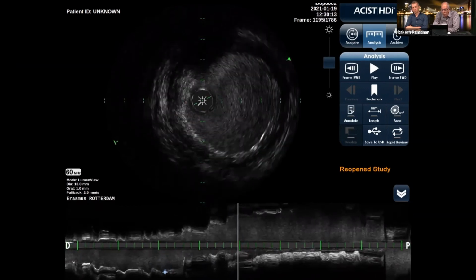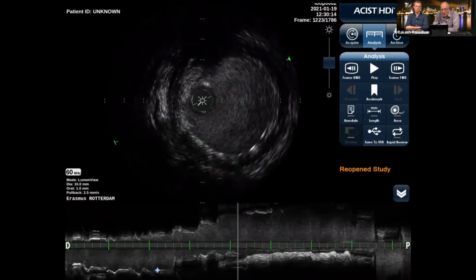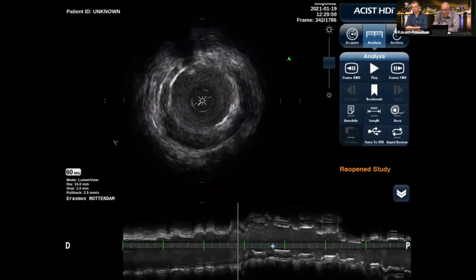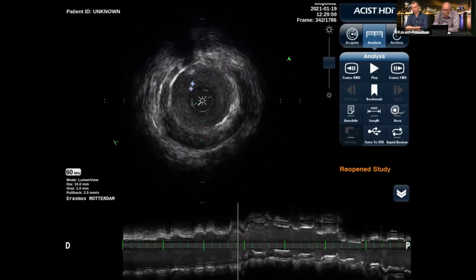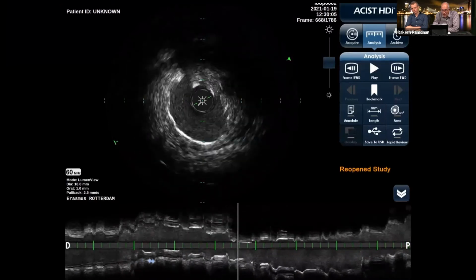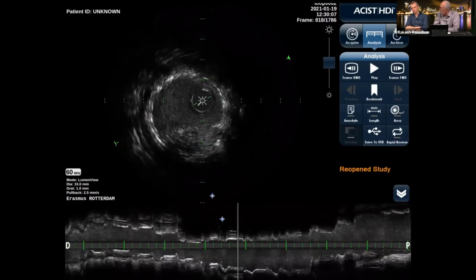So in the meantime, we already saw the thrombus protrusion. We in the meantime quickly looked at edge sections, proximal, we don't see one. Distal, that's the one that can play a part, also not in here. And that's why I would understand that you tend maybe to post dilate on the distal edge, but you don't want to go outside. So I would fully understand that the operator would leave this. But what was done, they were a bit concerned about the thrombus protrusion.